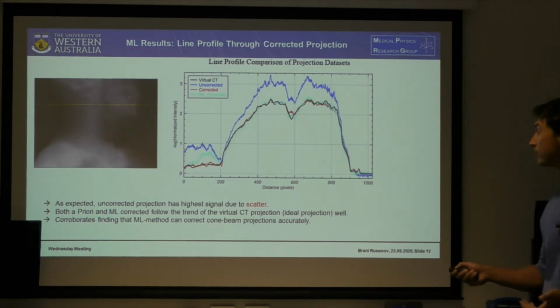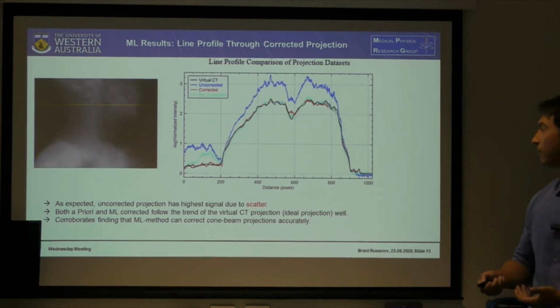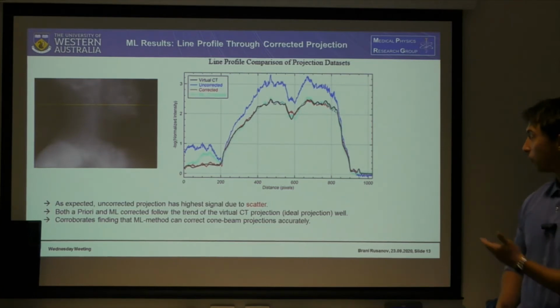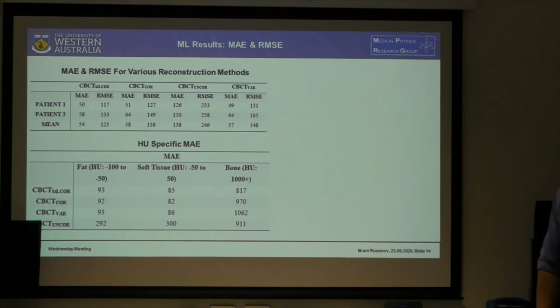It's not perfect. For example, here it's underestimated the intensity, and here it's overestimated the intensity, but this is just a byproduct of the fact that I've trained on 4 phantoms, and it's a machine learning approach. It's not deterministic. There's always going to be some errors involved with it, but it's performing quite well, as you can see by how well it's fitting to those lines.